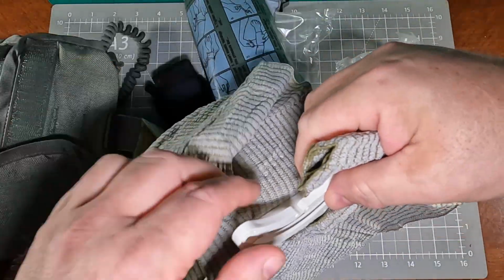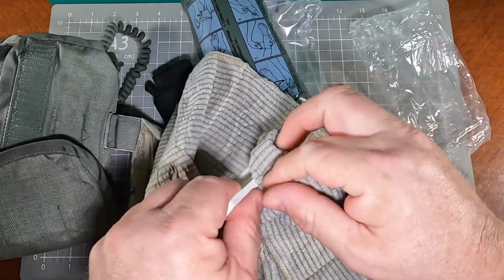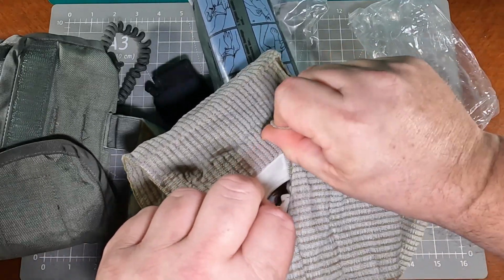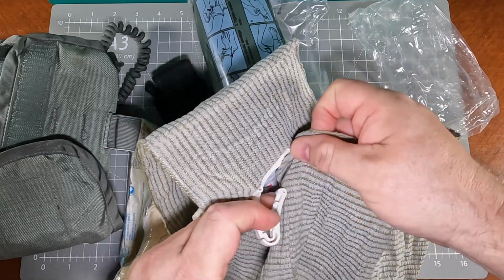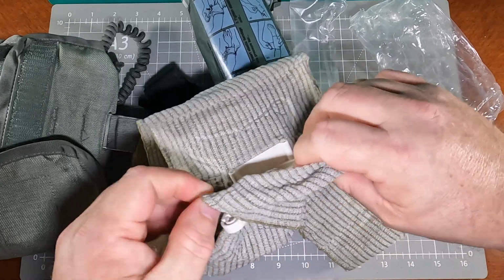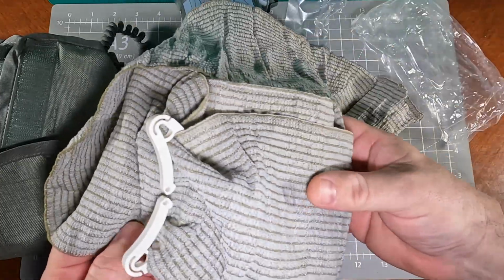And then when you get finished, you can pull it in kind of tight into this little tab here, and this tab's basically like a pressure bar. Run around here. And the pressure bar helps you apply pressure if you need to apply pressure depending on the circumstance. You can use it as a regular bandage, you can use it as a pressure dressing, or you can end up using it as a tourniquet.